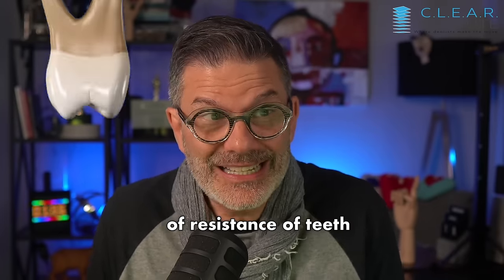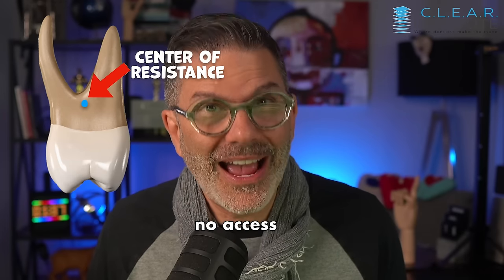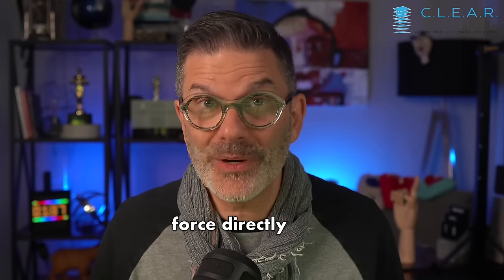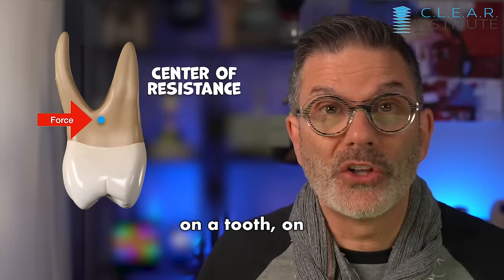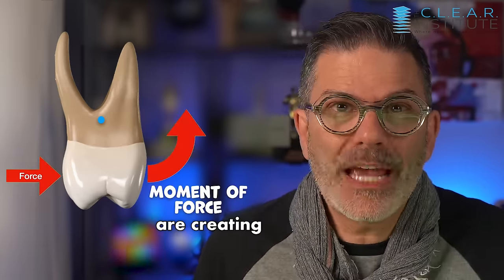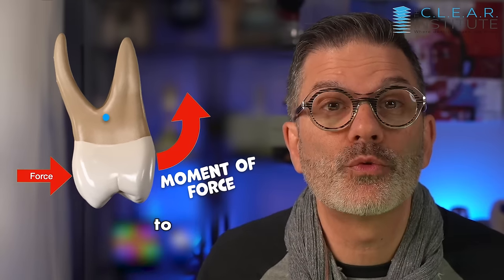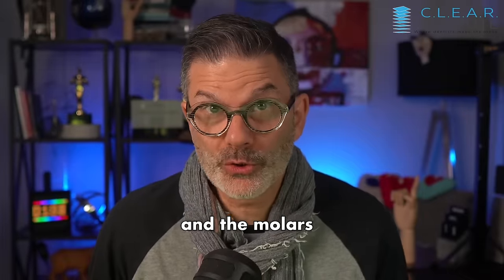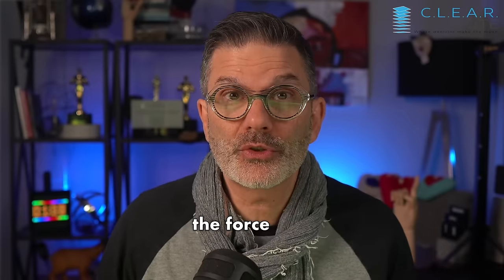The center of resistance of teeth is located somewhere in the root, and we have no access to it. We can never apply a force directly in line with it. That means that every time we apply a force on the clinical crown of a tooth, we're creating a moment — a moment of force — and that is a tendency to rotate. When you push on the premolars and the molars to expand the arch, they will want to tip buccally. It is a normal reaction to the force we're applying.